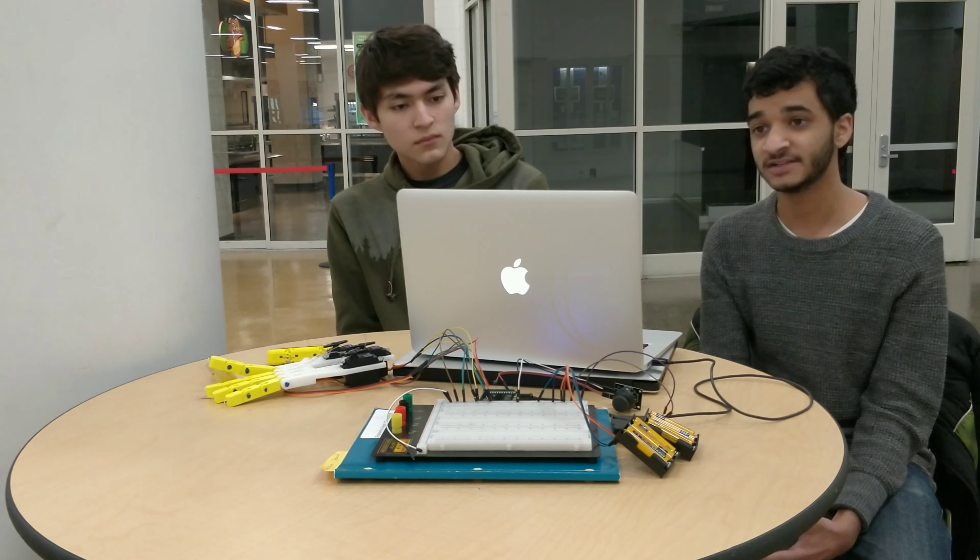Our project aimed at meeting this need by finding low-cost parts through which a robotic hand could be made. Our goals were to keep costs under $50, have moving fingers, and be able to grip objects.